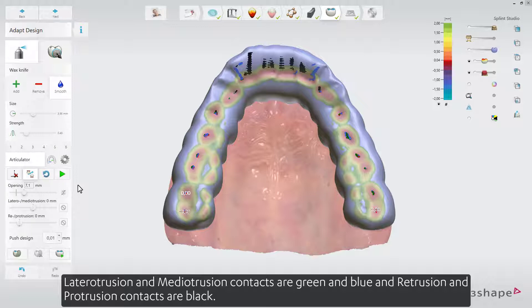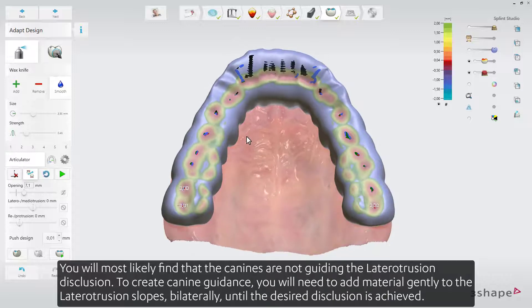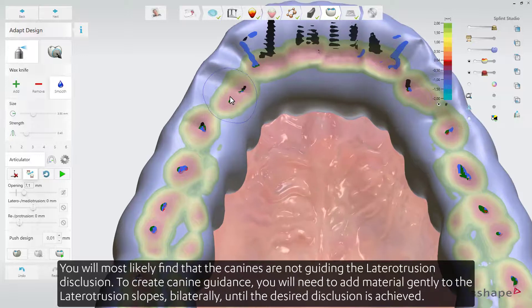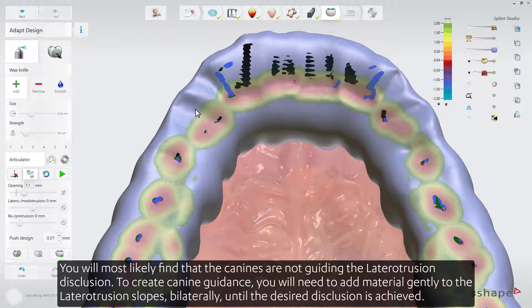Retrusion and Protrusion contacts are black. You will most likely find that the canines are not guiding the Lateral-Otrusion disclusion. To create canine guidance, you'll need to add material gently to the Lateral-Otrusion slopes, bilaterally, until the desired disclusion is achieved.